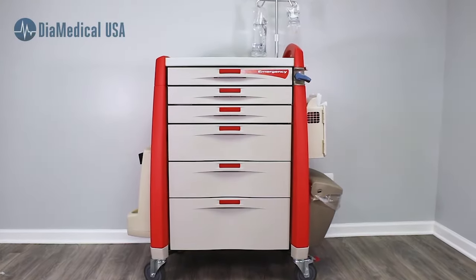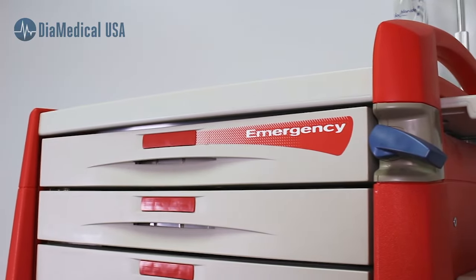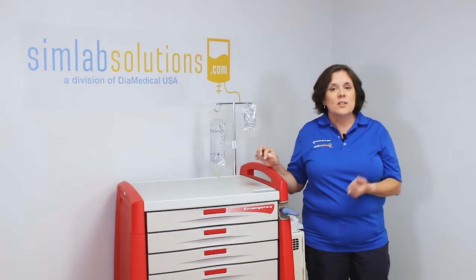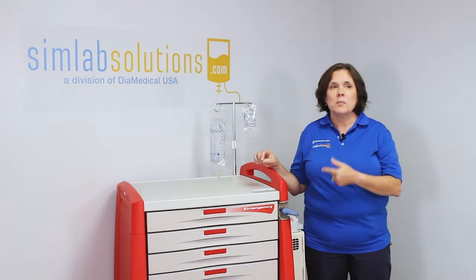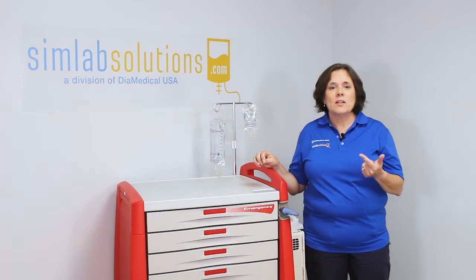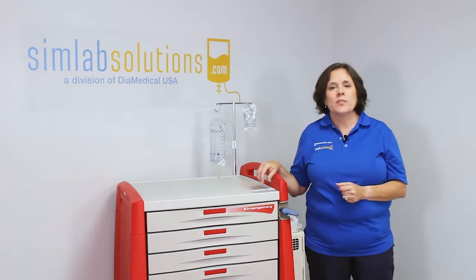Each drawer has its own use. Loaded crash carts are ideally designed for all types of patient resuscitation training scenarios. Students benefit greatly from both pediatric and adult mock code simulations. These carts can also be used as part of ACLS and PALS certification programs.